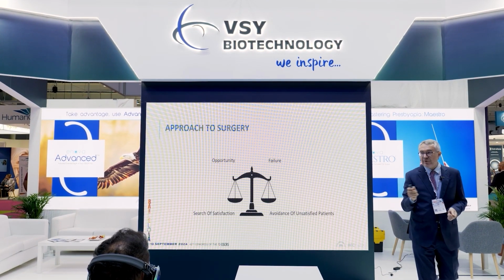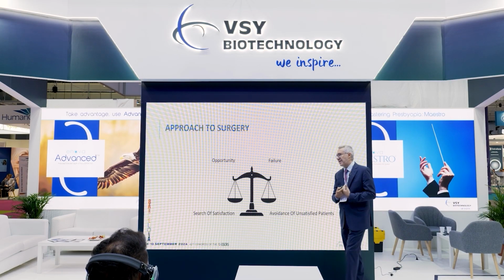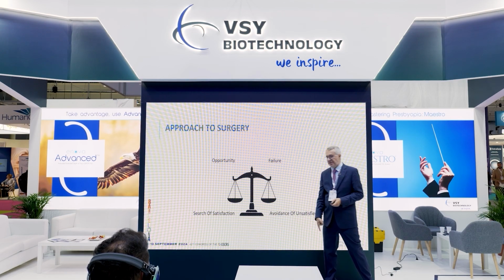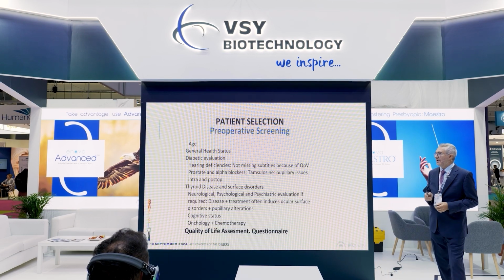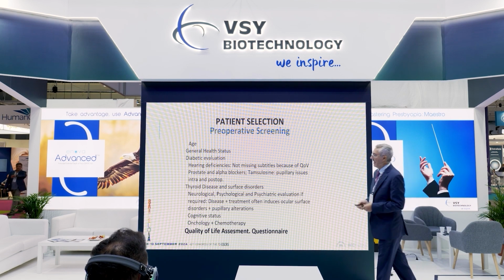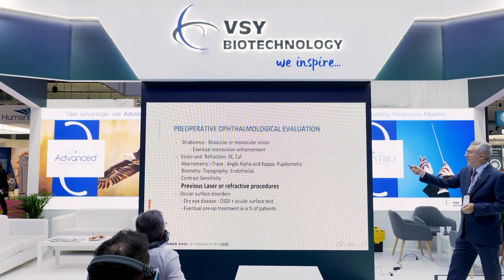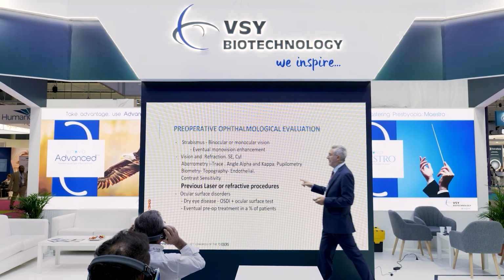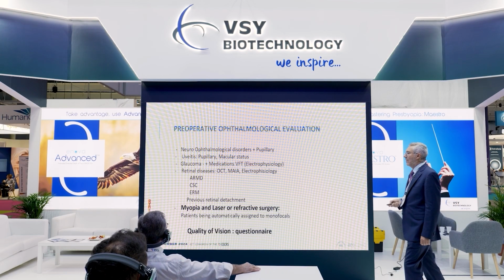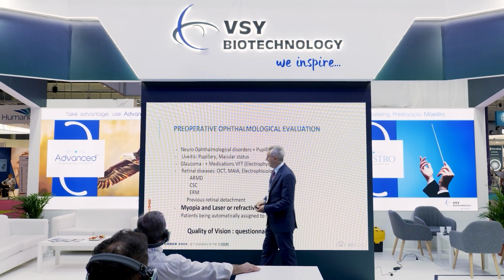As surgeons, whenever we approach a surgery, we need to find a balance, and it always depends on our own psychology: the opportunity of aiming for the moon, but always fearing shooting yourself in the foot. A failure is something that you want to avoid, and this type of lens offers a very broad security margin. Here, in the ophthalmological evaluation, we have included aberrometry with the eye trace, and always the retinal and glaucoma issues, alongside the pupillary reactivity.